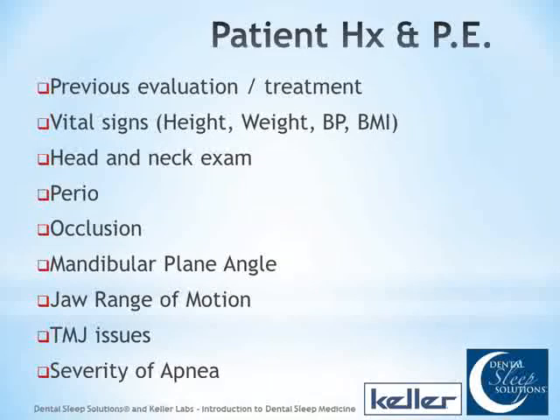One thing I want to mention is you said TMJ issues, and there was a question that came in also about can you make devices? Is it a contraindication? TMJ issues a contraindication for mandibular advancement devices? The answer is no, not usually. Often, many TMJ problems, clicking, popping, we don't have time to get into all of them here, but suffice it to say that many people with quote unquote TMJ issues or TMD are still very good candidates for dental appliances. And you need to make sure your physicians know that that's not a contraindication as well, so that they don't disqualify someone because of something they're not really qualified to decide.